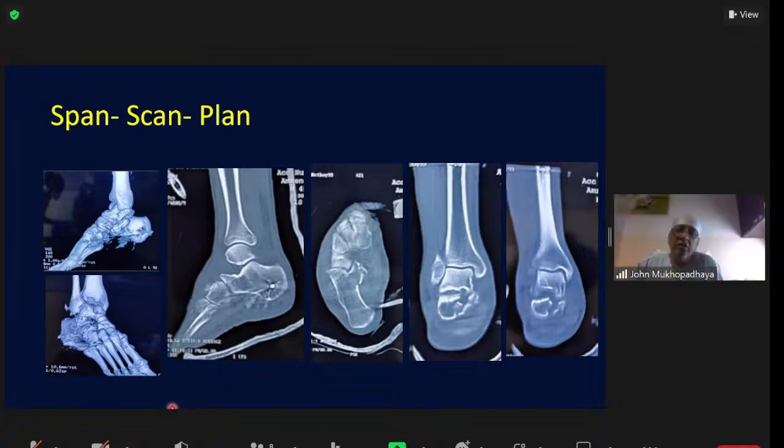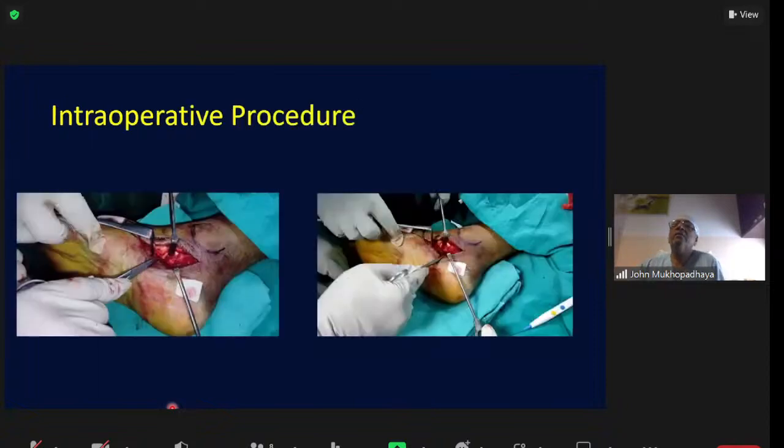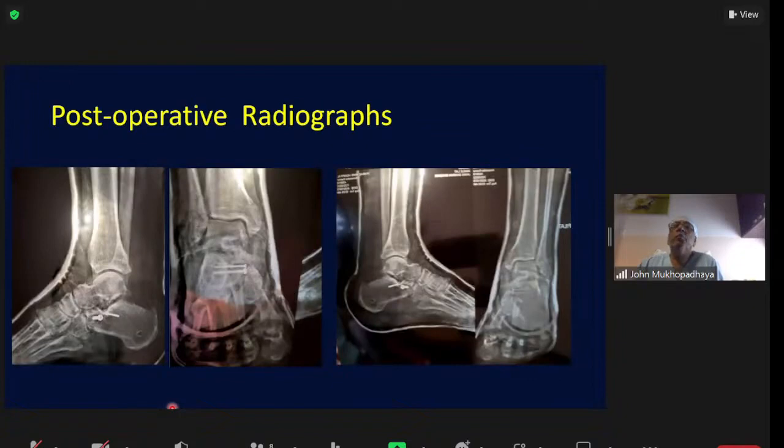Okay. All of these. So you need to know your anatomy to be able to keep these safe when you're approaching it from here. And then you have to find the sustentaculum fragment, reduce it, and then fix it, okay? So that's the approach. You can see the medial approach. That's the fragment there. Then we reduced it, that's the fragment that you're moving there. And then we fixed it provisionally, first with K-wires and then with screws. Okay. So there are two screws fixing the fragment there. That was the post-op picture.